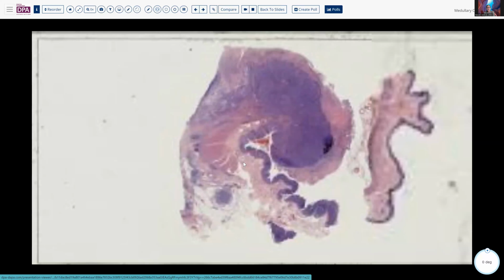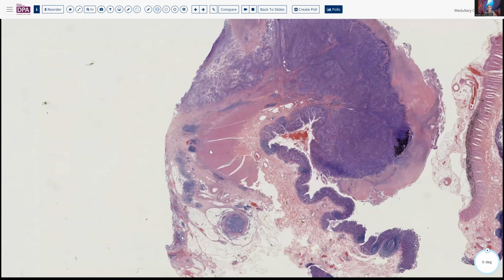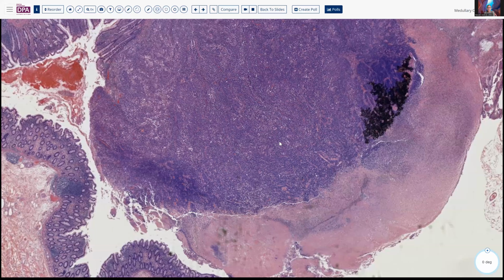So on microscopic examination, this lesion had a mucosal component, which you can see nicely here with areas of ulceration and extension to the surrounding tissues. Now, note we have a fair bit of inflammatory tissue here, or either extension of the tumor. But we'll focus first on the surface lesion, and you can see here a nice area of erosion into a very, very blue tumor. So here's the surface necrosis, obviously the cause of bleeding or those sorts of symptoms.